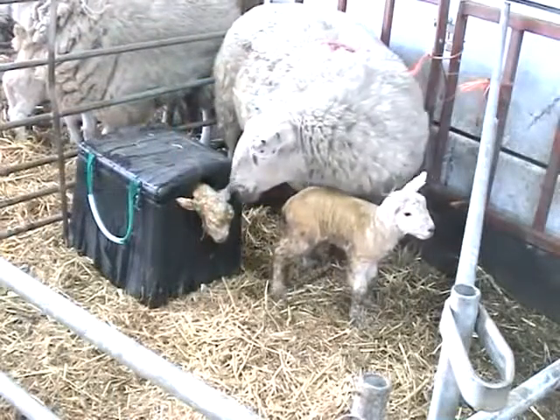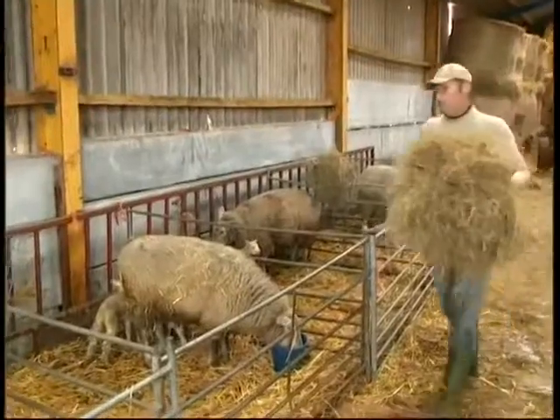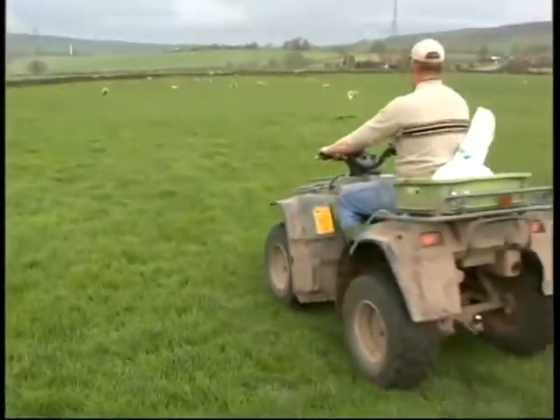Leave the Woolly Warmer in the pen alongside the ewe, so preventing mis-mothering. Utilising this unique method, it leaves the ewe free to tend to the rest of the flock whilst the lamb warms naturally.